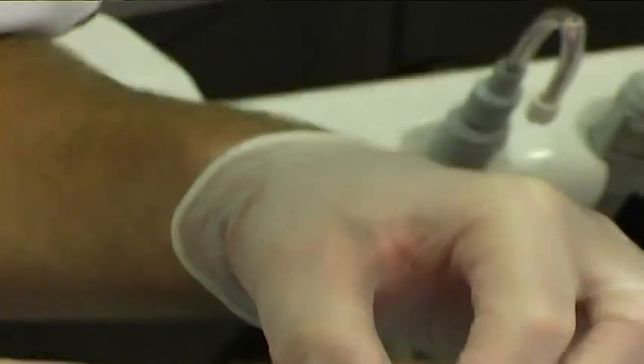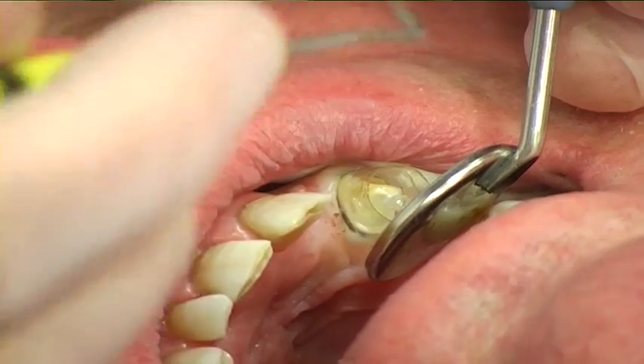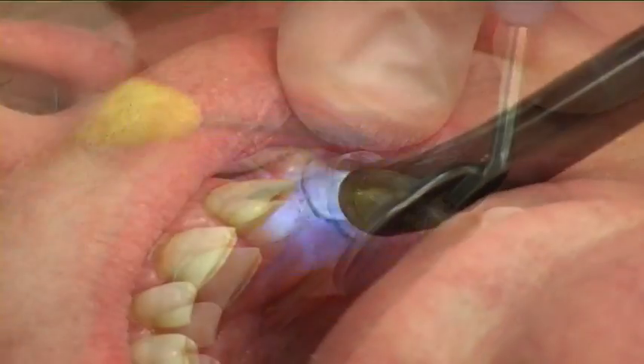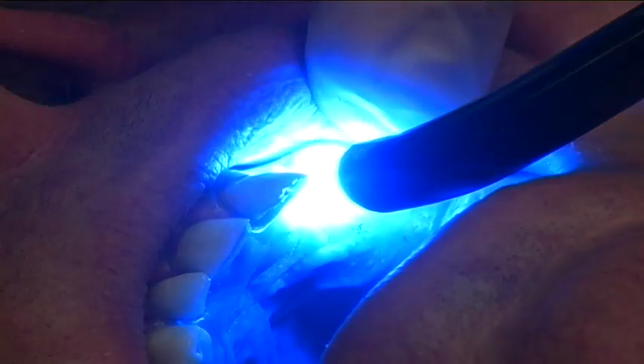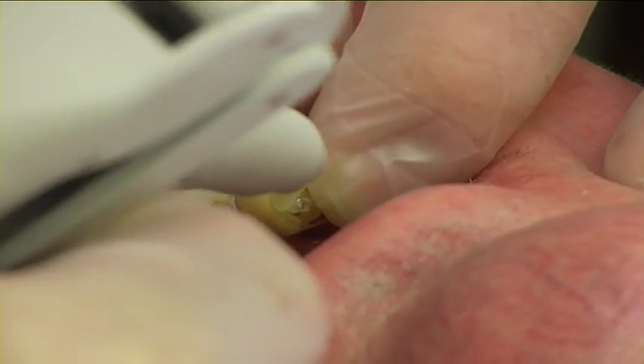The post was inserted into the root canal. Excess cement was removed and the cement was light-cured. The core was built up using composite core material.